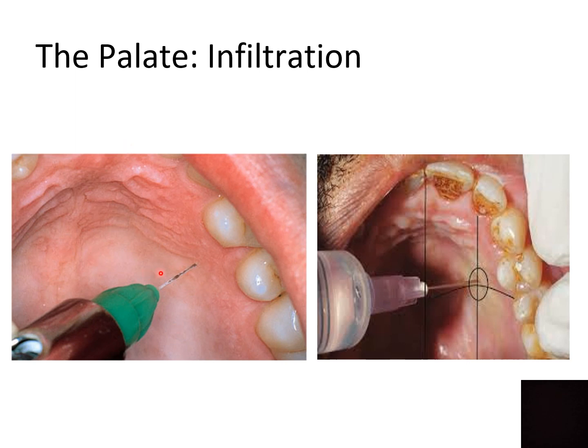As you know, the palatal mucosa is directly bound to the underlying periosteum. That is why we call it a mucoperiosteum. And inadvertently, all injections on the palate are subperiosteal, and that is why they are so painful. So palatal injections are generally considered to be the most painful of all the injections in the oral cavity. So again, basic principles: inject slowly and inject a little volume.